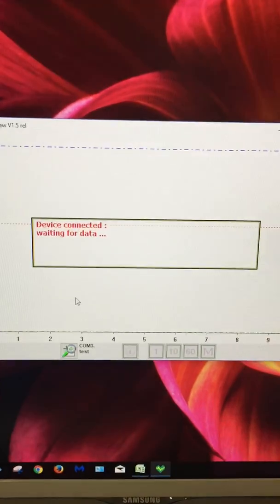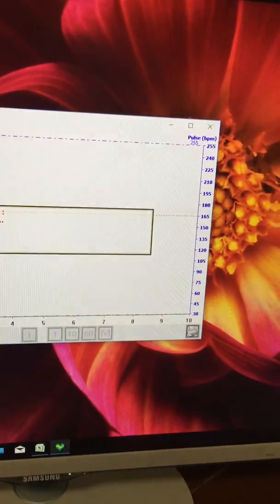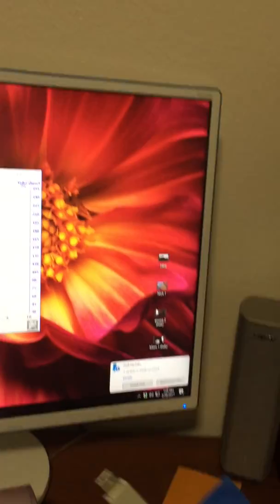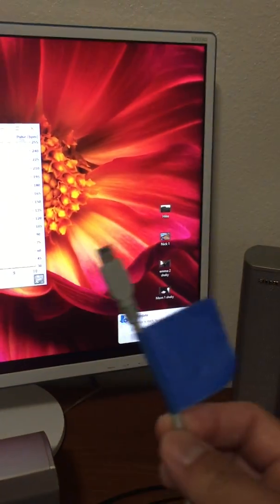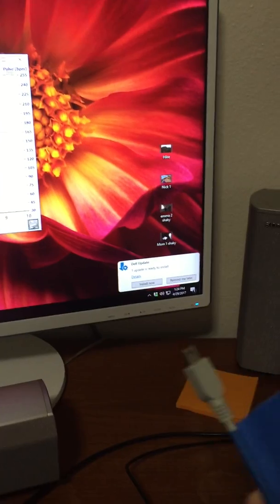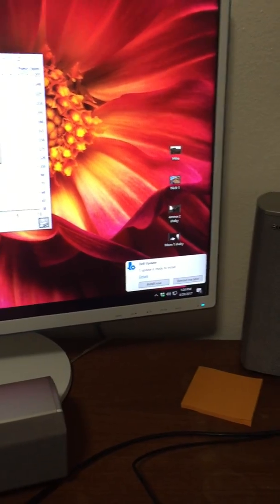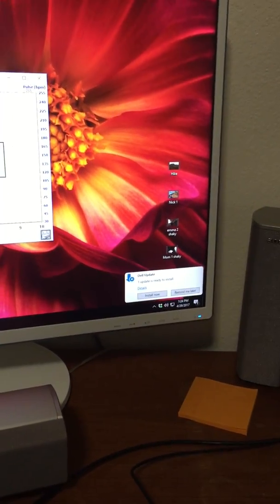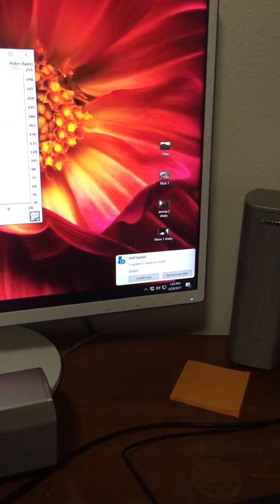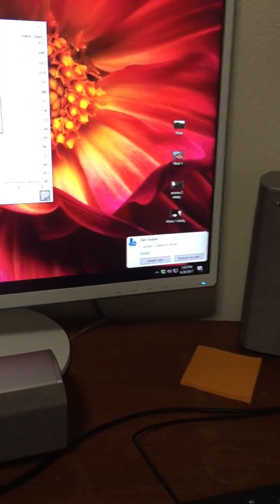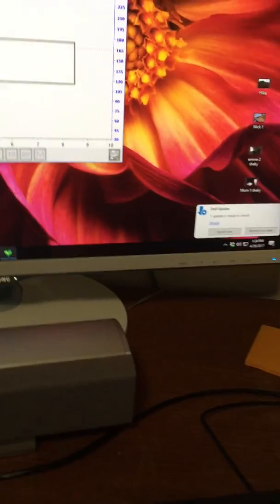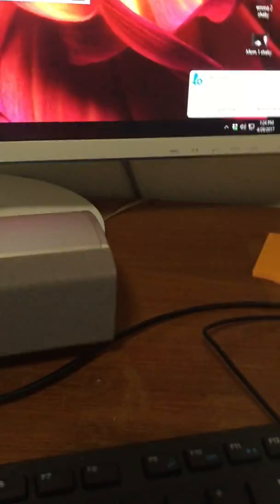It says waiting for data, but it's not connected. Then you need to connect it with the specific USB cord that came with the oximeter because no other cords will work. It has some sort of chip in it, so don't lose that cord.